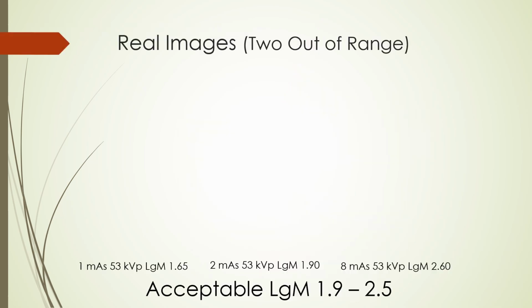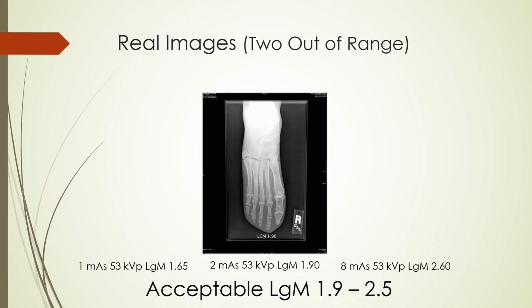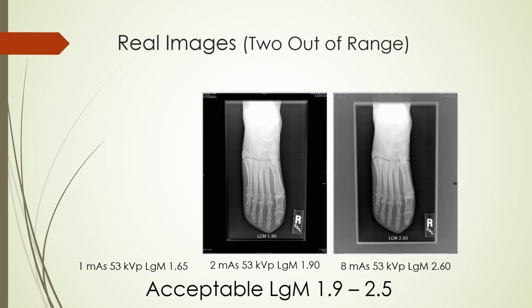Let's compare three images of the foot and speculate by their relative position on the hypothetical curve. The first image is a dorsal plantar projection of the foot. This image is calculated to have an lgM value of 1.9, the bottom of the acceptable exposure range set by AGFA. The radiograph on the right is just above proper exposure range. The image quality has been corrected by image post-processing. The image is acceptable except for the fact it was not masked properly.